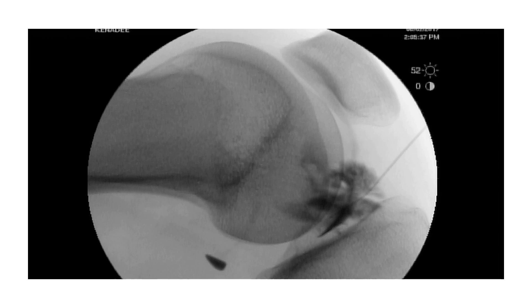This is the original injection — it's about the third or fourth needle reposition. You can see my needle cut under a lateral fluoroscopy view. The problem is, from the bottom, this is all I could get. There's nothing going any higher than this, so we still have that much of the ACL to cover. Anything else I inject at this point is just dumping out the back.